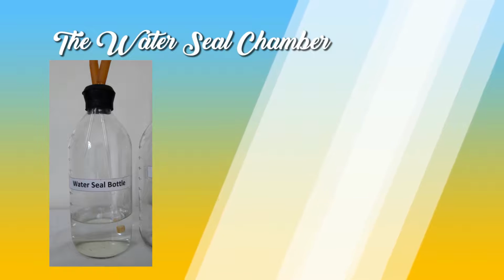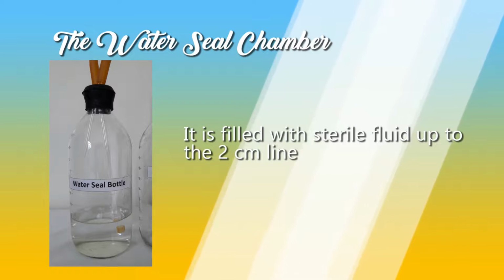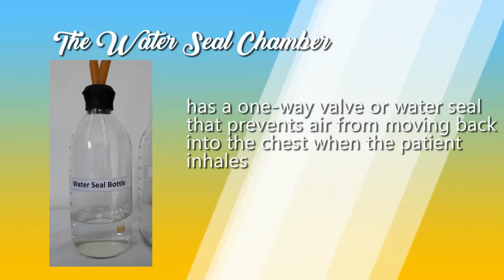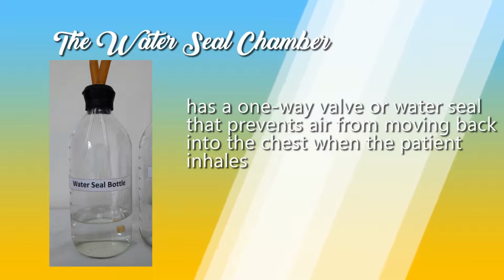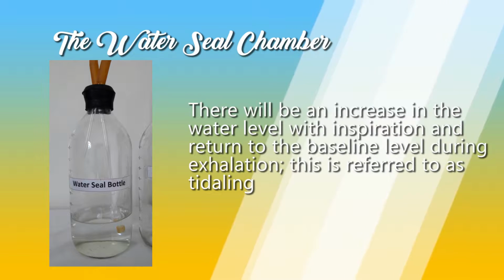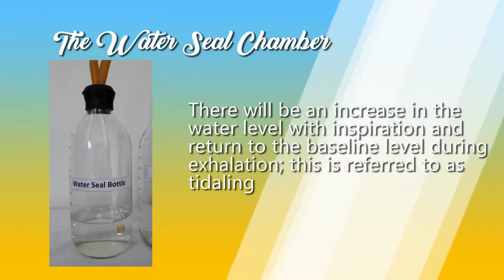The water seal chamber. It is filled with sterile fluid up to the 2 cm line. It has a one-way valve, or water seal, that prevents air from moving back into the chest when the patient inhales. There will be an increase in the water level with inspiration and a return to baseline during exhalation. This is referred to as tidalling.